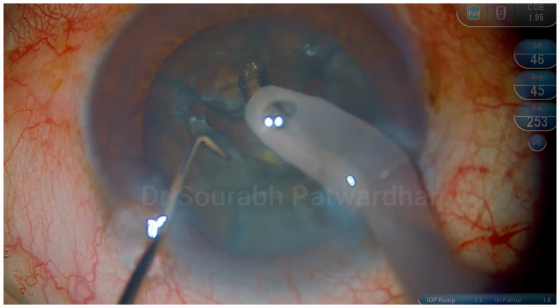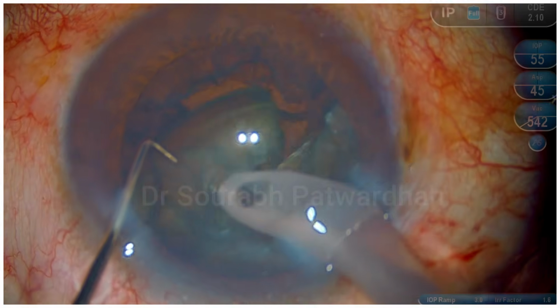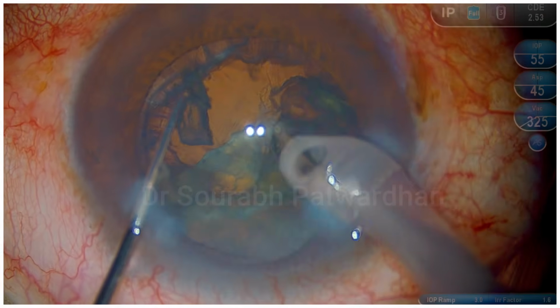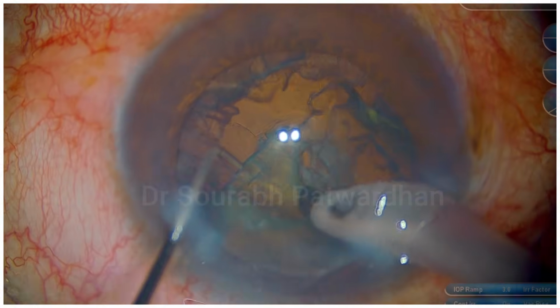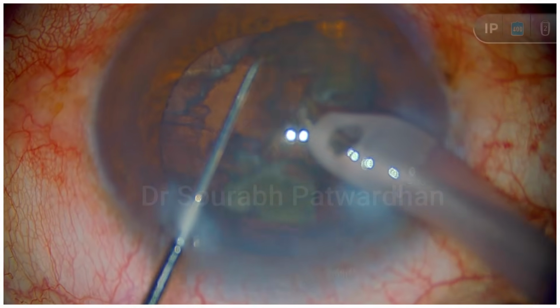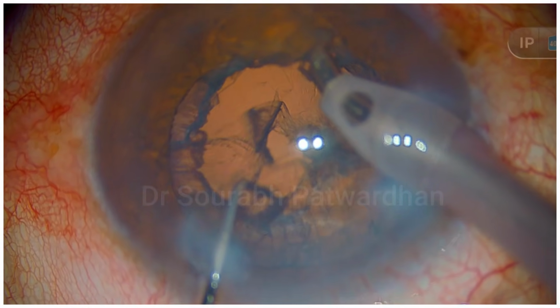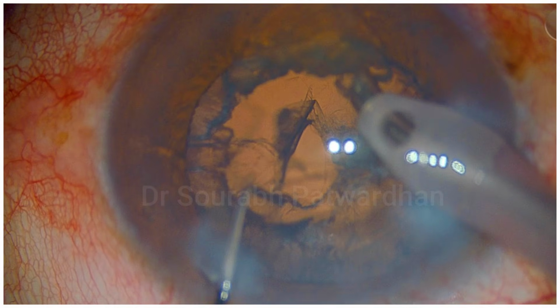And once the quadrants are there, which are well separated, I am going ahead with the quadrant removal with my usual settings, keeping high flow rate and high vacuum going up to 700. Two pieces done there, and there I sensed that something was wrong, and that's the reason why I just slowed down.